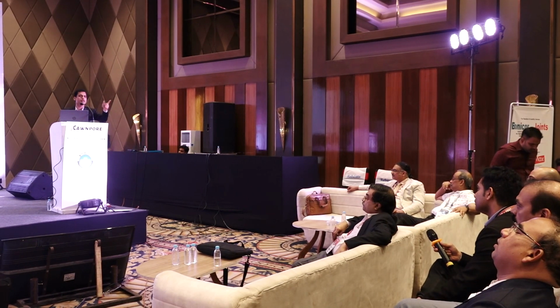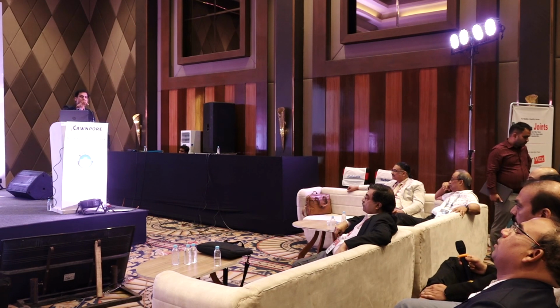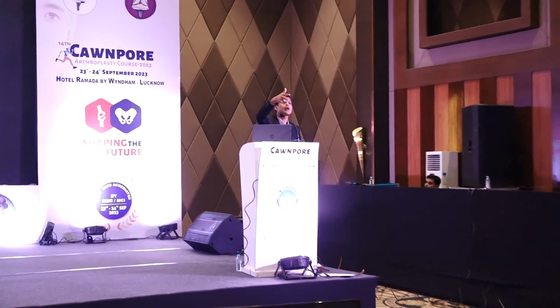If it is a cemented broken bipolar, don't hesitate, ETO is the choice. If it is an uncemented broken one, first go endofemoral and try to pull it out. The proximal will come out. Distally you have those long grabbers. I have a separate talk on that. You have a long grabber with the C-arm, try once or twice. If it is coming, pull it out. If it is not coming, don't waste time, go straight away to ETO.